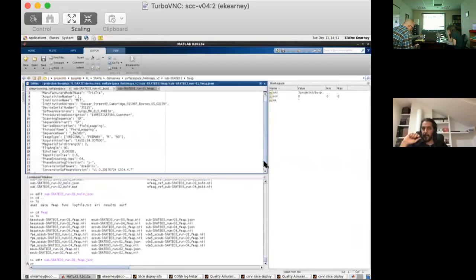polarity, but then also, depending on what converter you use, it may store data in rows that go from top to bottom, but sometimes it's not the case. So it sounds like the advice is to just give it a try both ways. Yeah, whenever I look for this information, I end up confident that we should just try both and figure out which one works on the data.